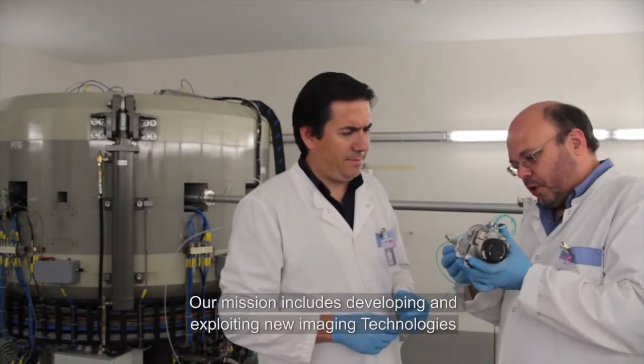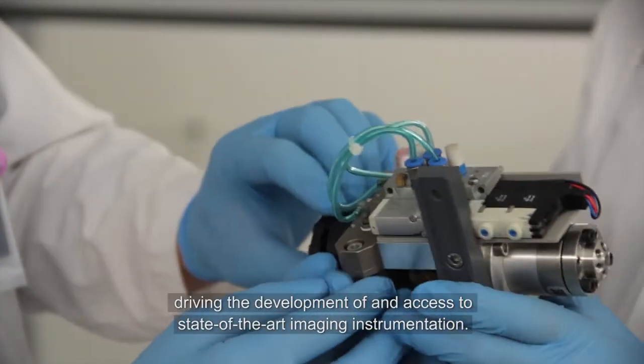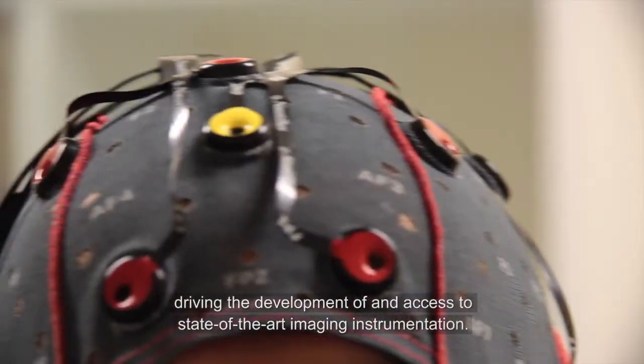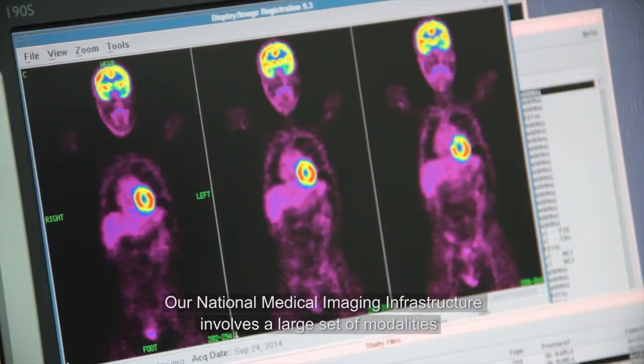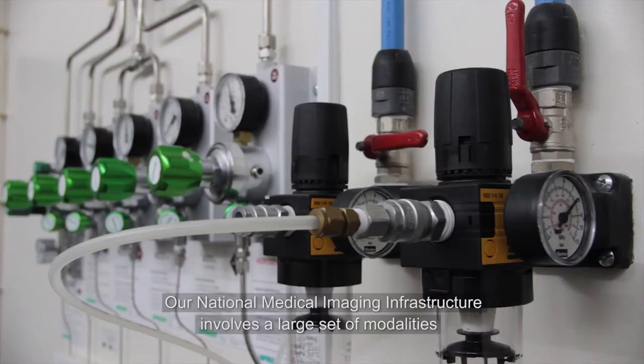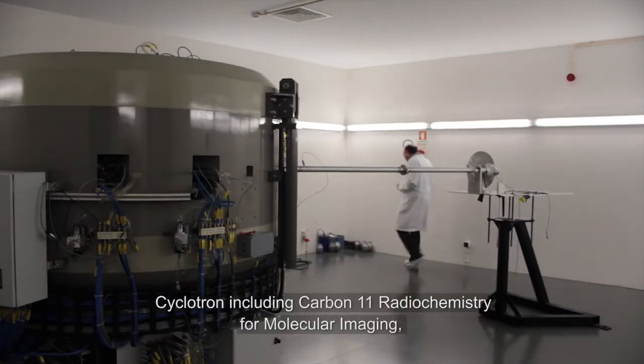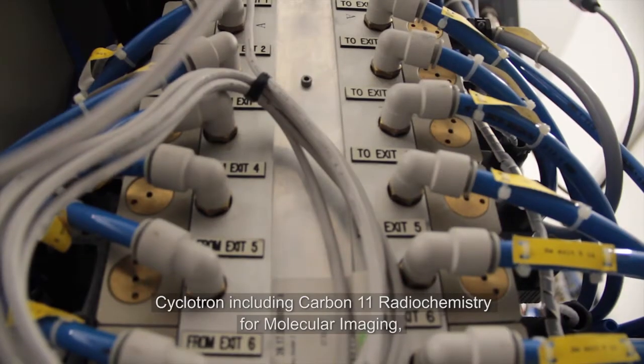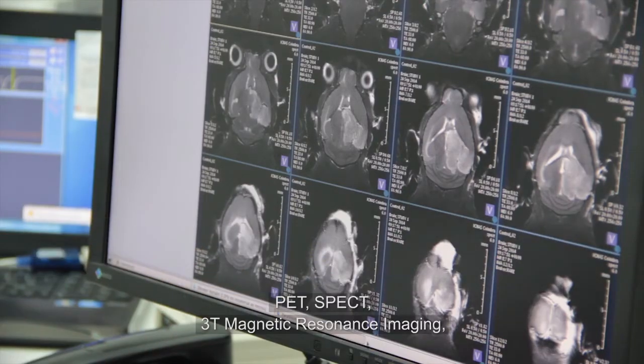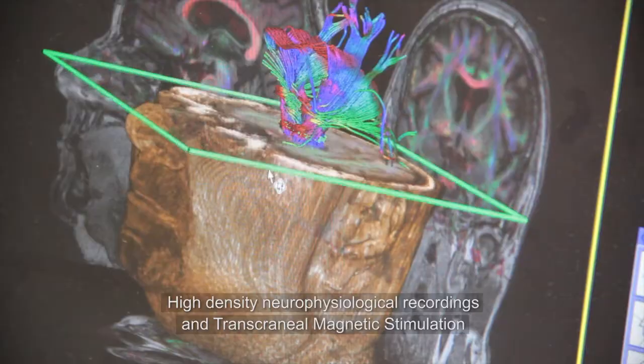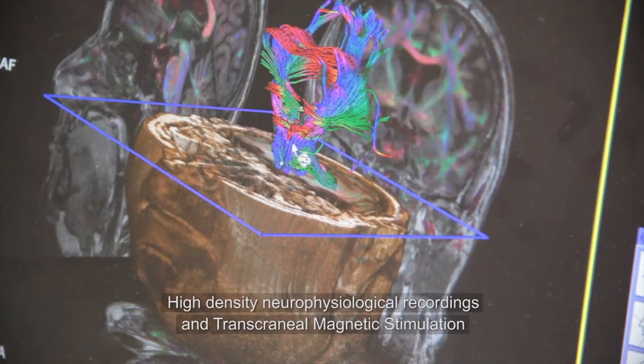Our mission includes developing and exploiting new imaging technologies, driving the development of and access to state-of-the-art imaging instrumentation. Our national medical imaging infrastructure involves a large set of modalities: cyclotron including carbon-11 radiochemistry for molecular imaging, PET, SPECT, 3T magnetic resonance imaging, high-density neurophysiological recordings and transcranial magnetic stimulation.